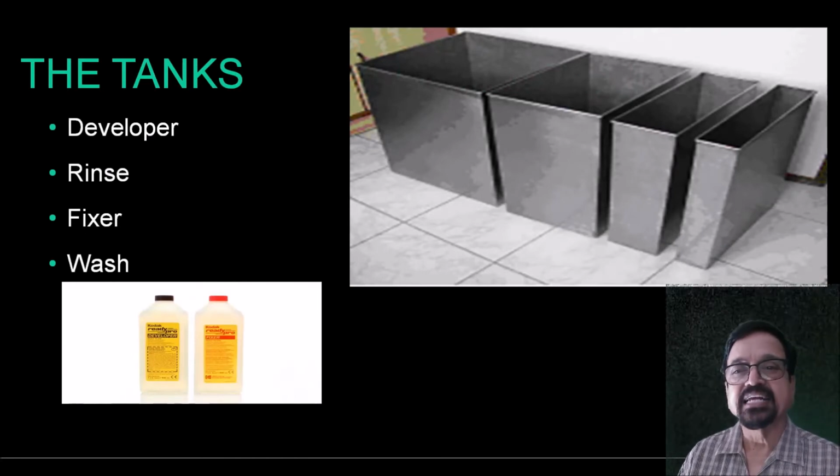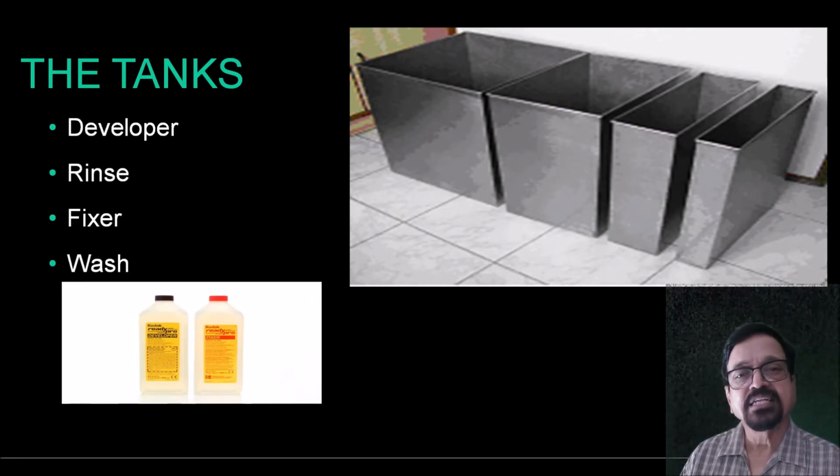Then coming to a fluorescent light to view wet films. Now here we are seeing how the tanks are. The developer is the smallest. For the simple reason, the more frequently you change the developer, the better it is, because developer has got a life. If it is exposed to light or it may be getting exhausted, then you get a bad contrast film, or sometimes the film after a few days gets orange colored. So for that reason, you should have fresh developer, means best if you have a small capacity developer.